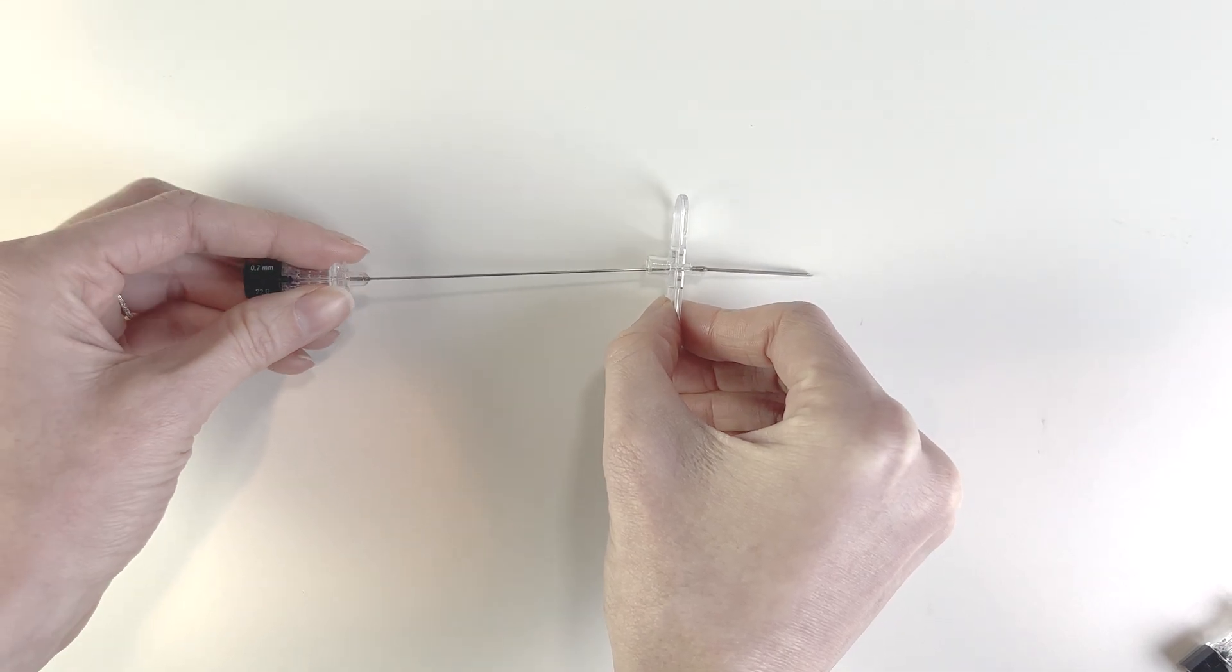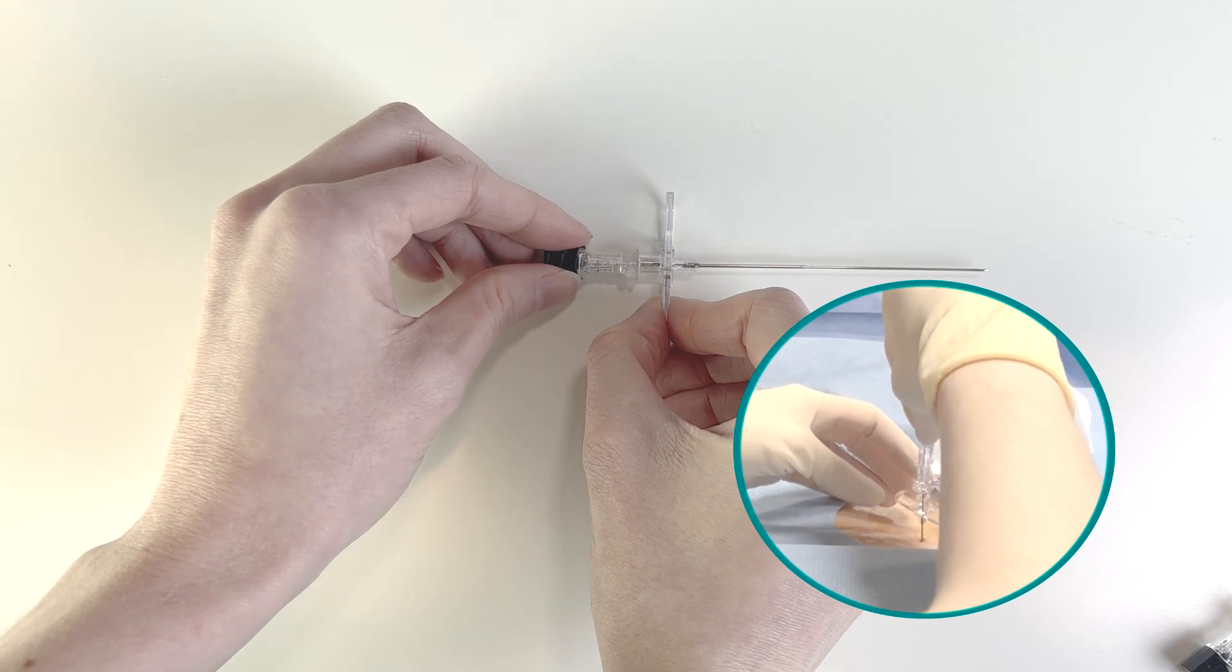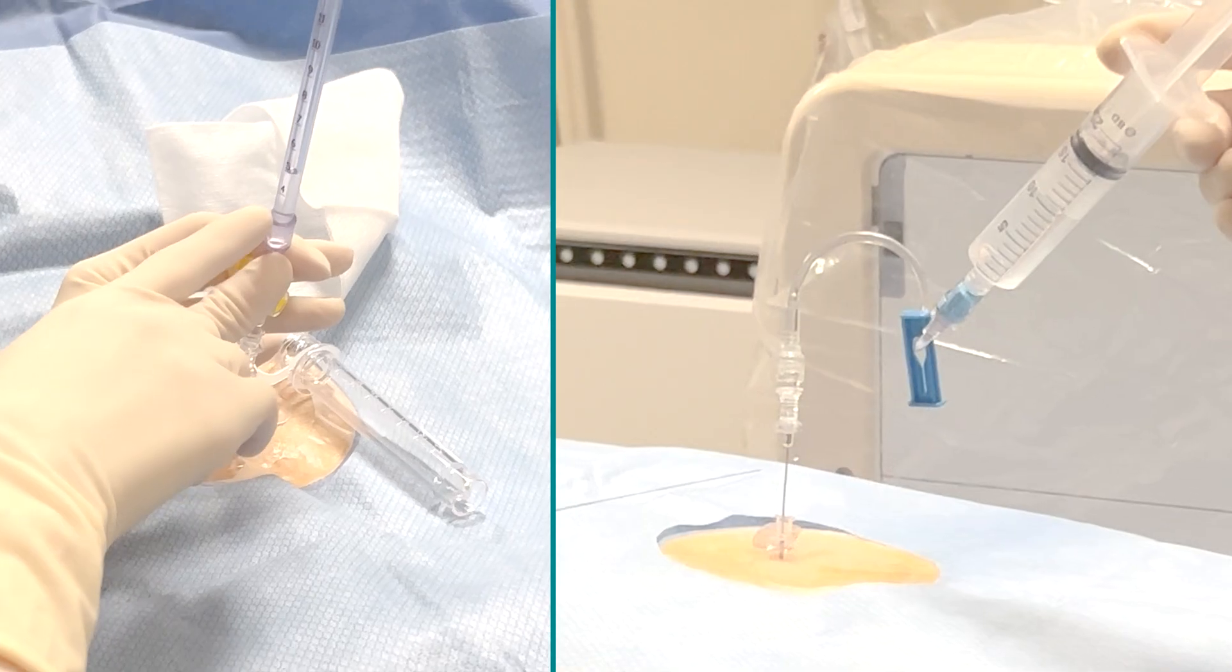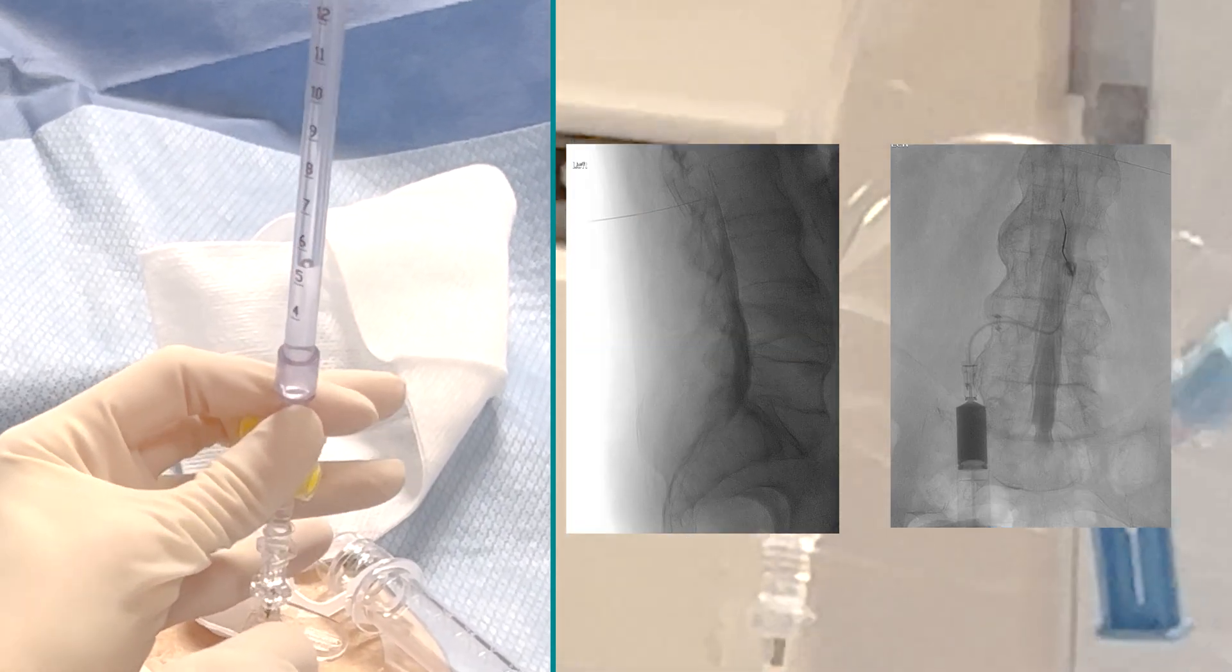Once you're satisfied with your angle of entry, you put your atraumatic needle through the introducer and remove the stylet to expose the little side port so the CSF can exit. At this point, you could just do whatever you normally do, whether it's getting a pressure measurement or injecting some contrast.